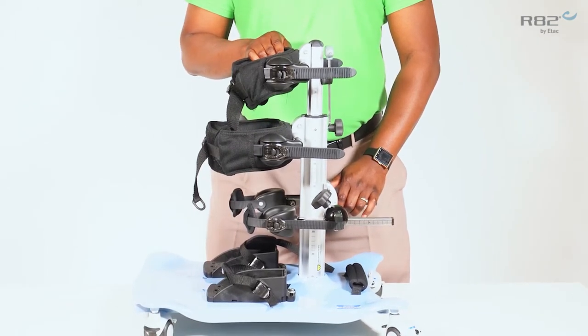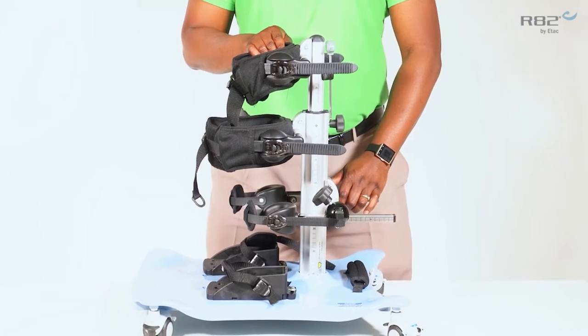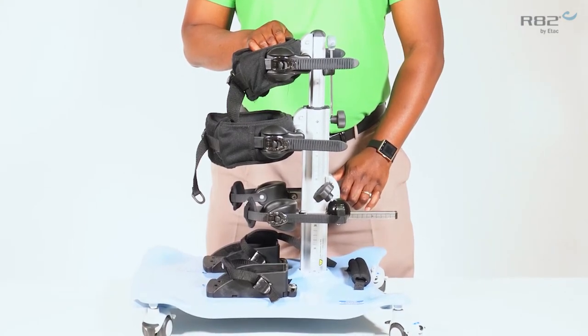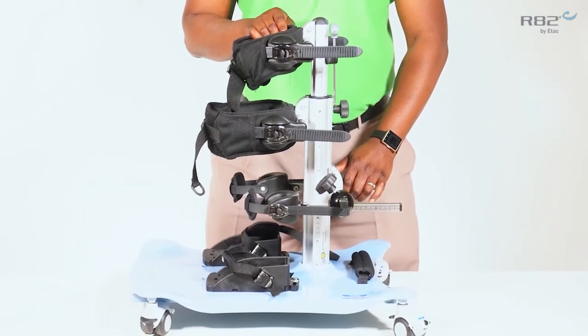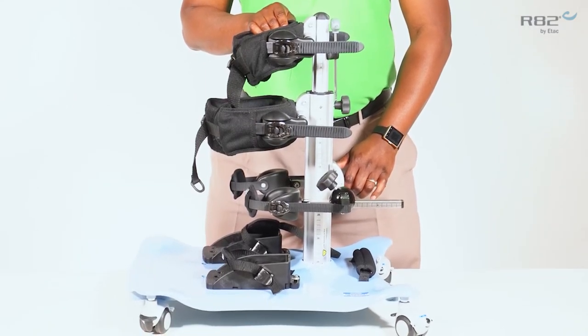The size 1 can accommodate a child as small as 27 inches, while the size 3 can accommodate a child up to 70 inches with a max user weight of 198 pounds.